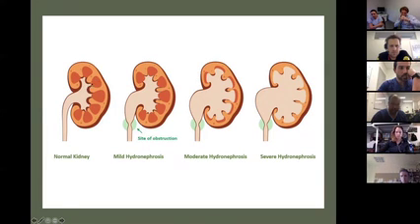All right. If you pay attention to that area, in a mild hydronephrosis, you still retain that collecting system structure. Obviously, it's bloated up. It is filled up with urine, but you're still maintaining your major calyceal system, minor calyceal system, and your papilla is still cup-shaped. It's concave, whatever the direction you look at. We call it concave for the time being.